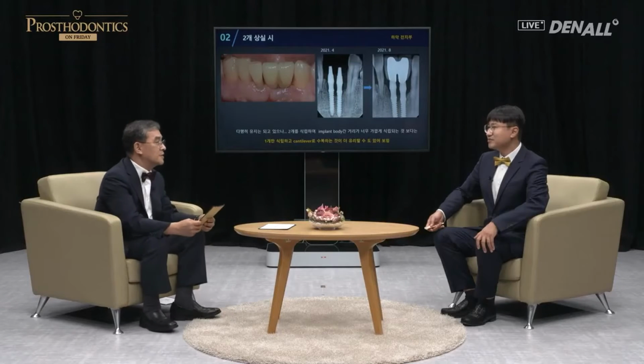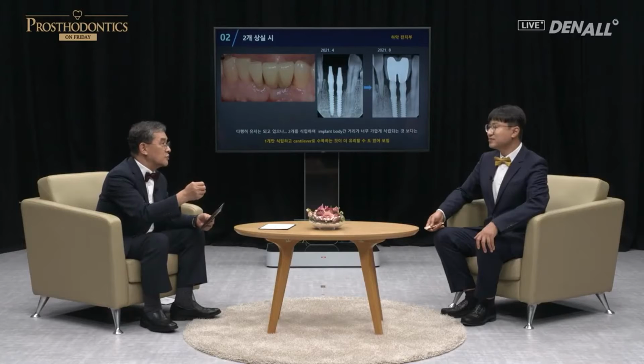In the lower anterior, space is limited. Labiolingually, there's not a lot of bone width. A lot of people place MS. I believe most of the people use MS. MS is one body and the diameter is thin. And therefore, the area for osseointegration is limited.